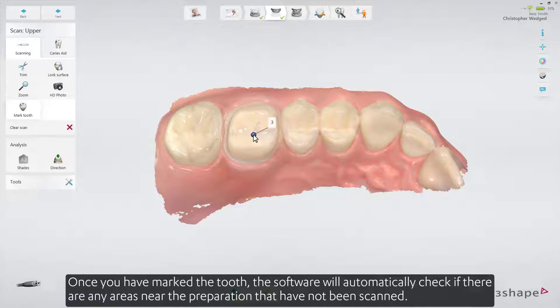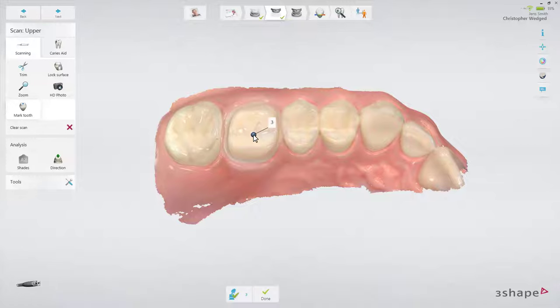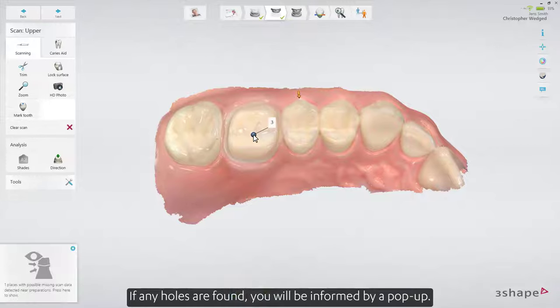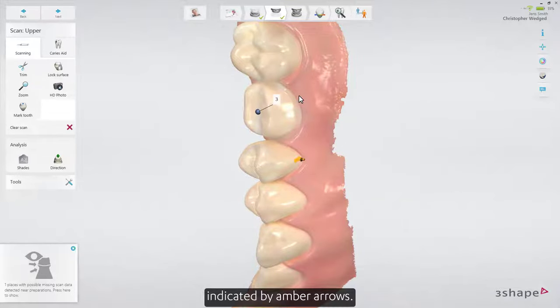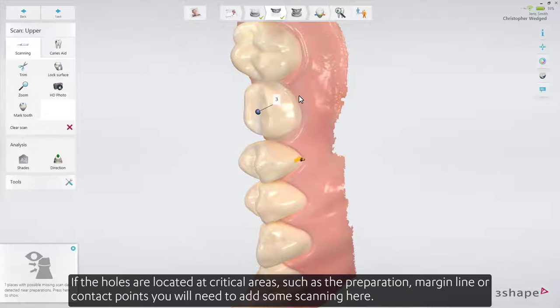Once you have marked the tooth, the software will automatically check if there are any areas near the preparation that have not been scanned. If any holes are found, you'll be informed by a pop-up. Pressing the pop-up will rotate the scan to show the areas not scanned, indicated by amber arrows. If the holes are located at critical areas such as the preparation, the margin line or contact points, you will need to add some scanning here. Otherwise, no further scanning is required.